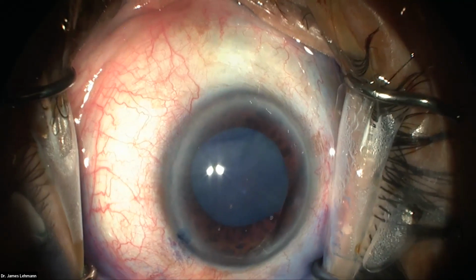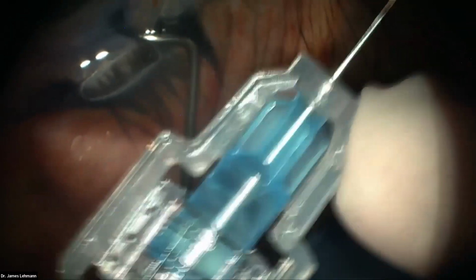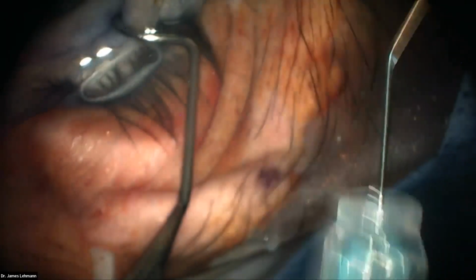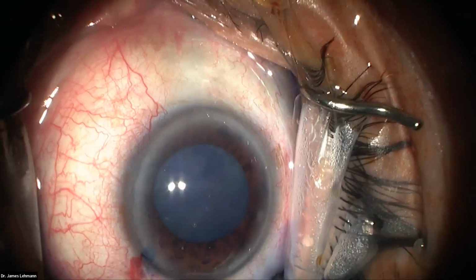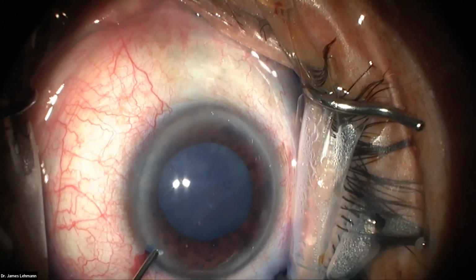Okay, now we're going to inject our viscoelastic, and we use two different kinds. The first is a dispersive. The last is a cohesive. I want to show you that there's a little plastic safety thing here on the viscoelastic cannula. If you don't have that, you need to hold it at the neck here so that when you inject, the little syringe part, the cannula part, doesn't go flying through the front part of the eye. But this has a safety mechanism, so I don't have to stress about that.